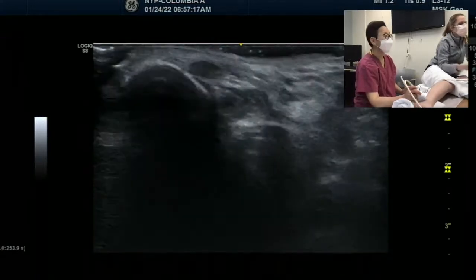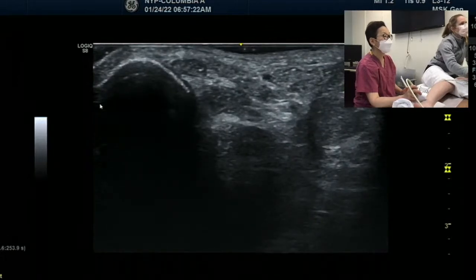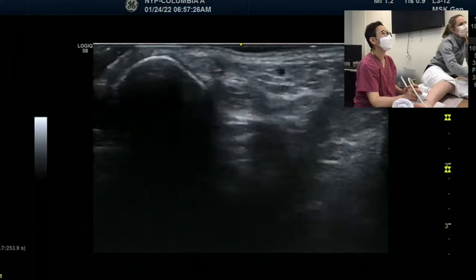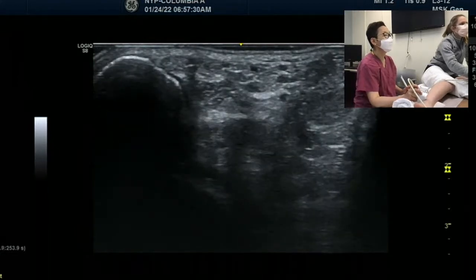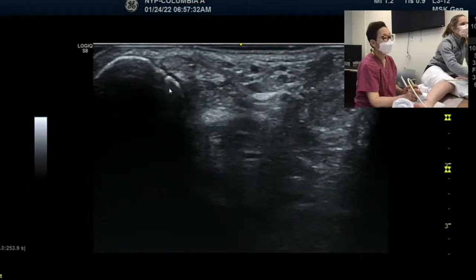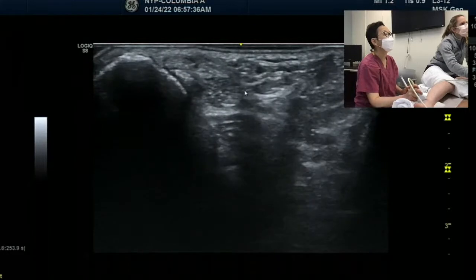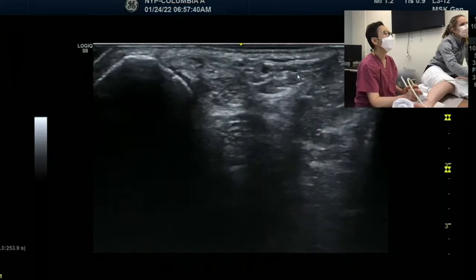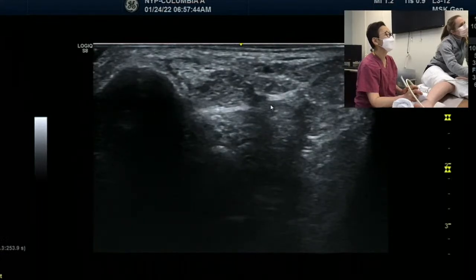If you look at it, the left side of the round is the lateral malleolus. And then the right side, above that white part, is the Achilles tendon. Right? So you can see two structures. Between the lateral malleolus and Achilles tendon, there are two round, dark ones.